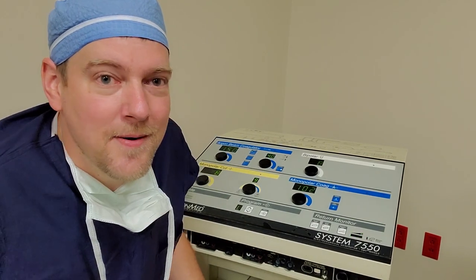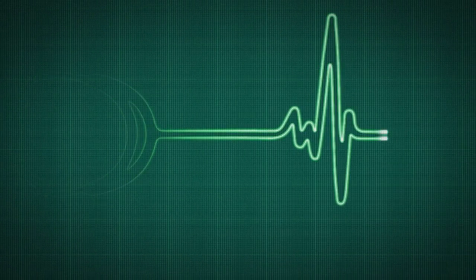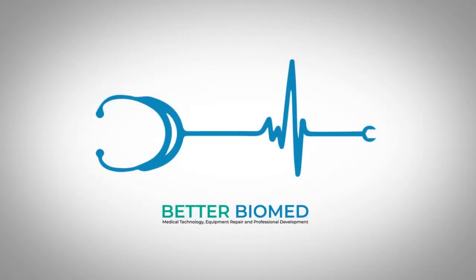Coming up next, right here on BetterBioMed. Welcome back to BetterBioMed. Today I'm going to show you a very special ESU — one that I don't get to play with too much because they're always very important and in very specific rooms that I normally can't get into. Today we're going to take a look at the argon plasma, or argon beam coagulator, ESU.